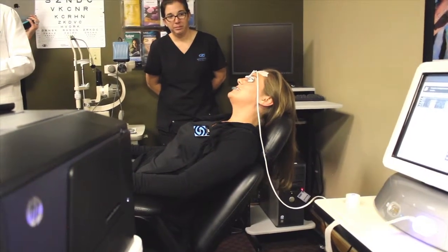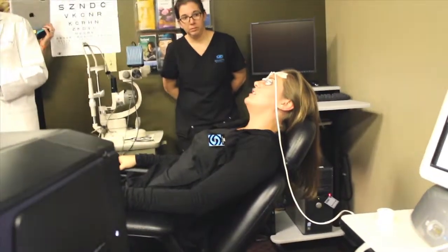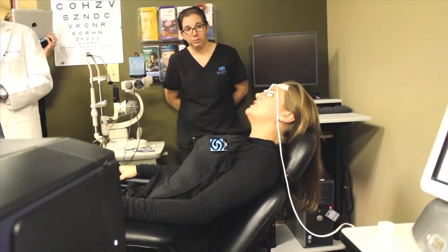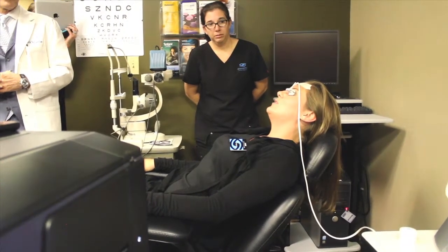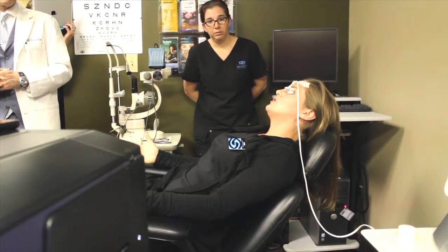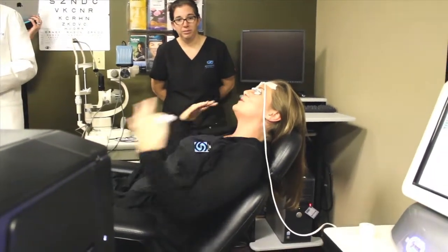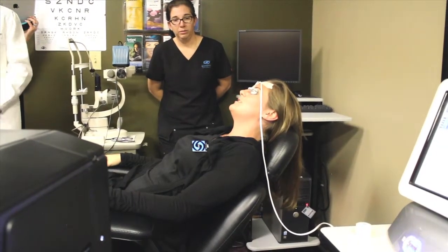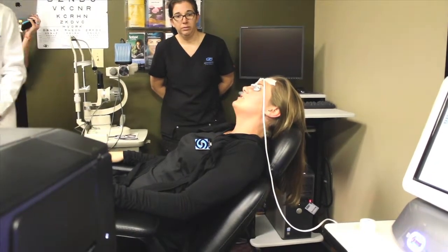The only way that I could describe it after having my right eye done was when you've been here all day and your eyes are on fire and you go home and you get a really hot washcloth to where you're going to burn your skin and you put it on your eyes and it feels so good for just a few seconds, but then it cools off. It feels like that for 12 minutes.